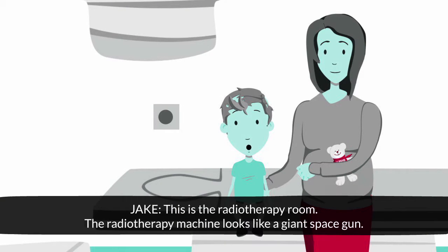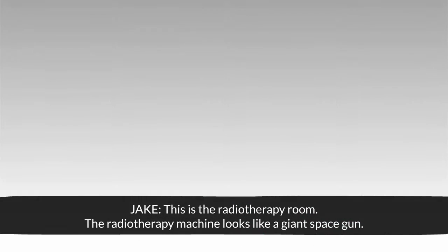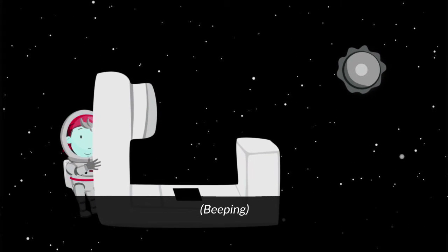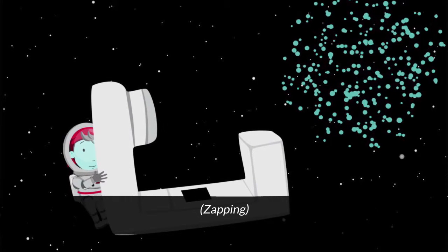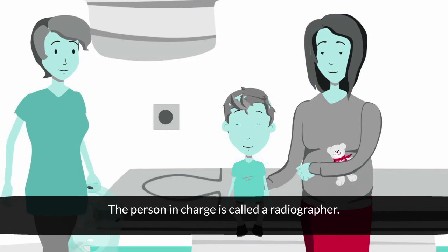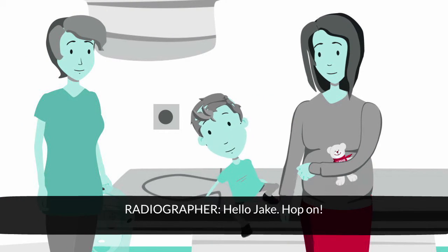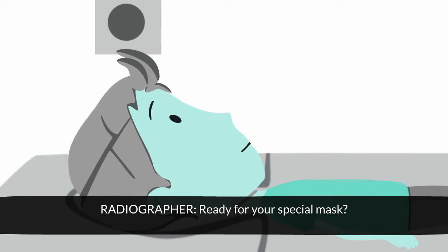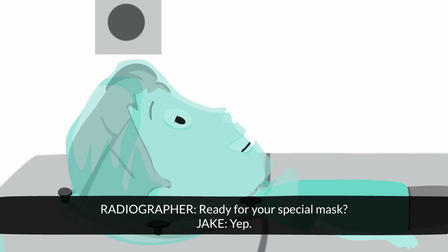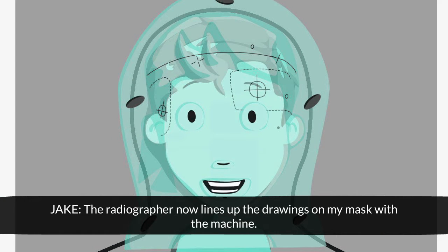This is the radiotherapy room. The radiotherapy machine looks like a giant space gun. The person in charge is called a radiographer. Hello, Jake. Hop on. Ready for your special mask? Yep. The radiographer now lines up the drawings on my mask with the machine.